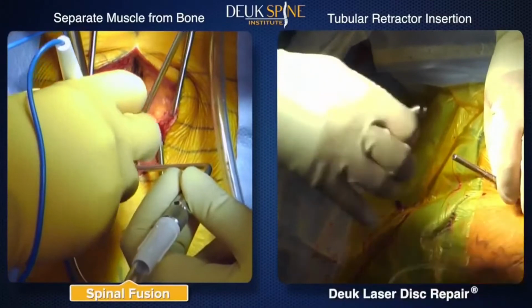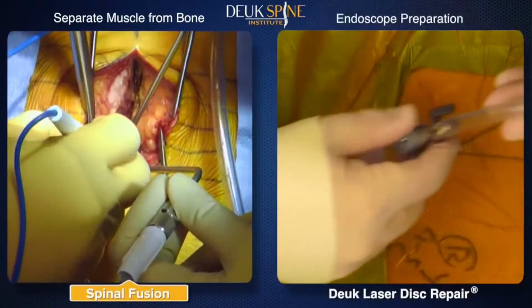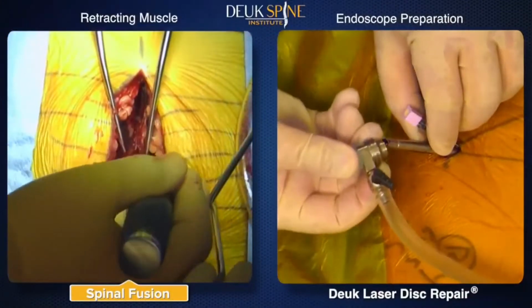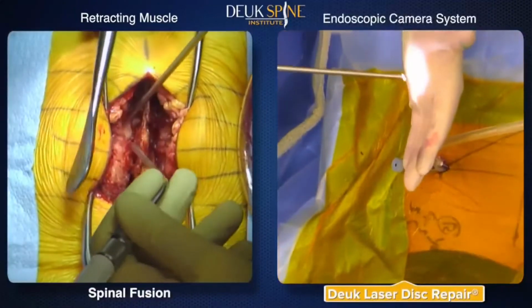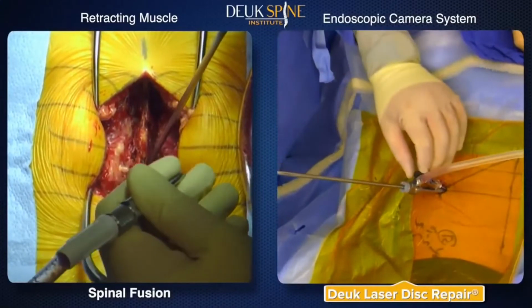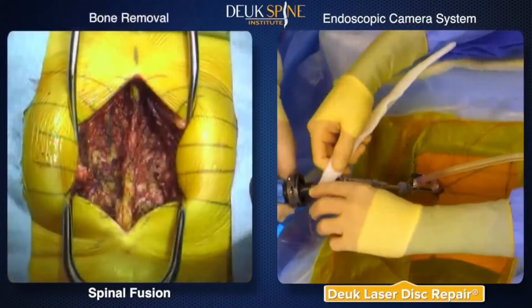To access the spine, the spinal fusion requires the muscle to be separated from the vertebrae. This very invasive action causes trauma and permanent damage to the muscles. Whereas in the endoscopic Deuk laser disc repair, the muscle is not damaged. The endoscope camera is inserted into the tubular retractor to allow the surgeon to guide the laser inside each symptomatic disc.